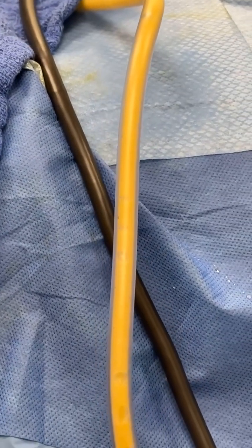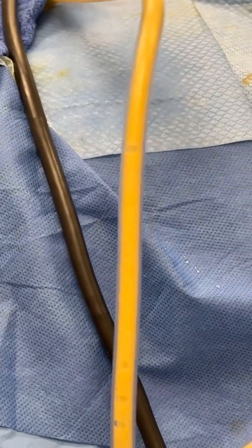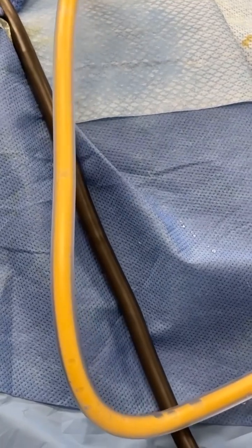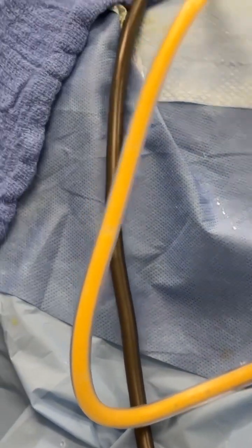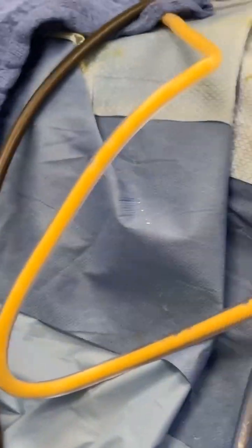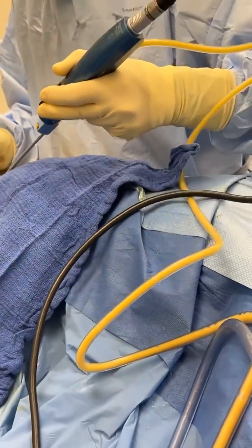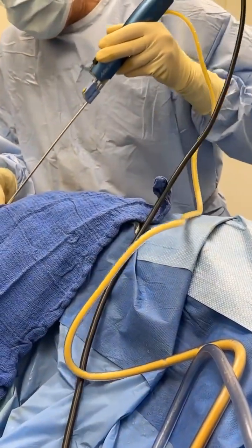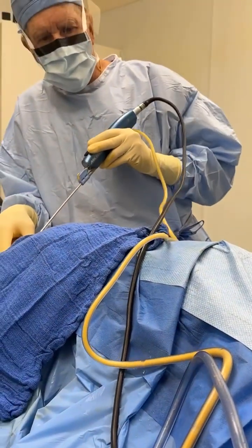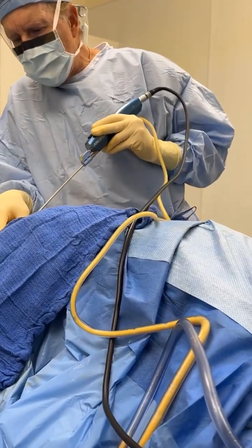And I told a patient yesterday, don't even look at my past videos, look at tomorrow's, and see if there is any blood loss. And that's the way we do it. This patient is not having a fat transfer, but if she was going to have a fat transfer, guess what? That's the fat that's going to be transferred into her buttocks. Of pure fat, not red, not pink.